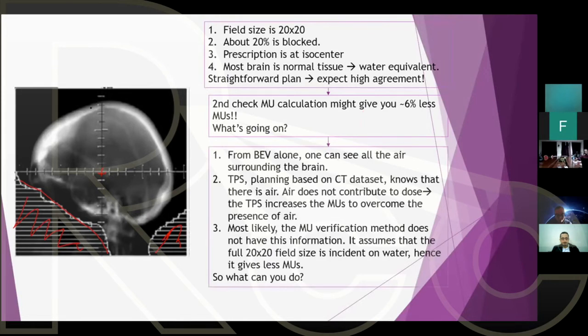Let's look at the beam's eye view. You can see that you have air. This over here is air.